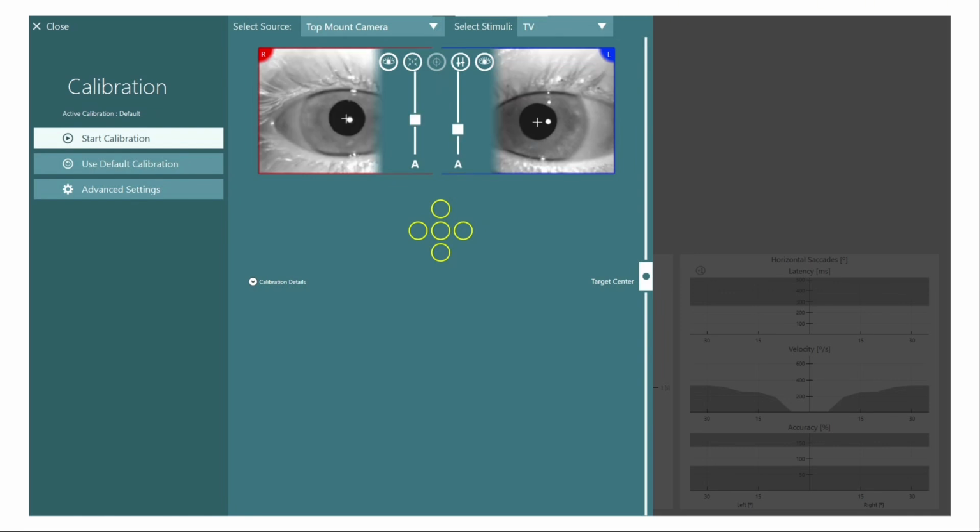I usually do that so that I can get the plus signs locked on pretty good. So for this patient, I set it about right here so that I had enough darkness that it's really focusing in on the pupil, which should be the darkest point on the screen here. And that's another reason why you want to make sure that patients don't have any eye makeup, eyeliner, mascara, anything like that on, because it can cause this to be more difficult. But this can help in that case, whether they have eye makeup or not. Okay, so we've made some adjustments on the eye.